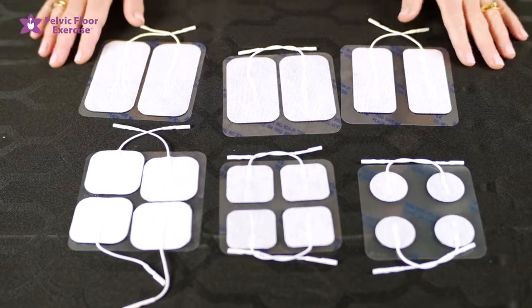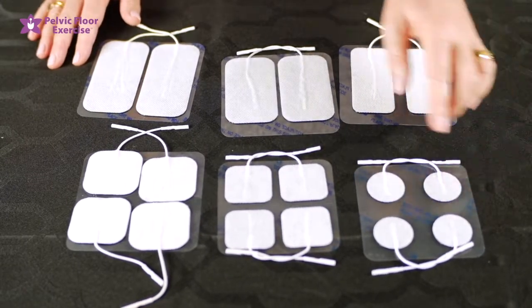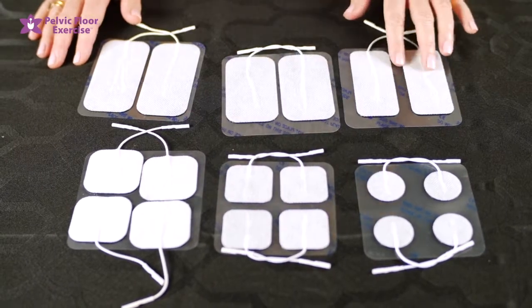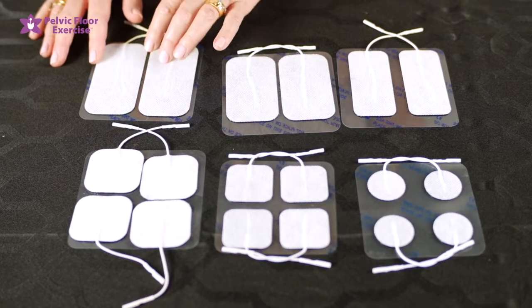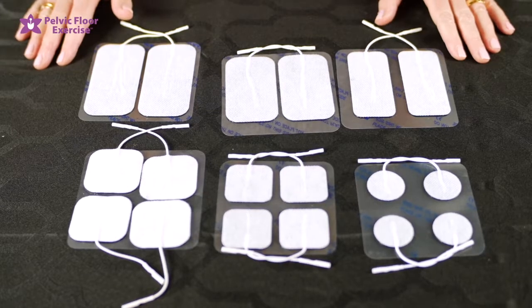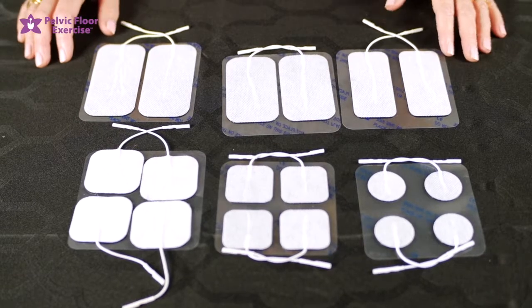First we're going to look at the adhesive external electrodes. They come in a range of sizes starting with the small 30 millimeter diameter round ones, 40 by 40 millimeter, 50 by 50, 40 by 90, 50 by 90, and the 100 by 90 millimeters. Which size you choose depends very much on what area of the body you're treating and what your intention of the treatment is.